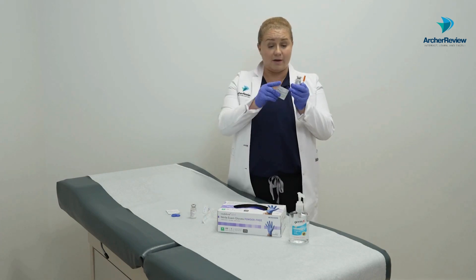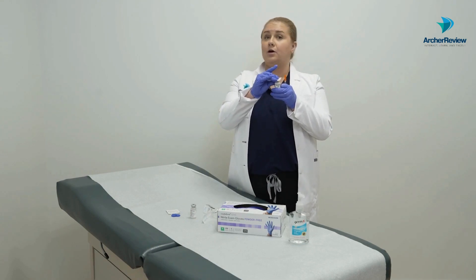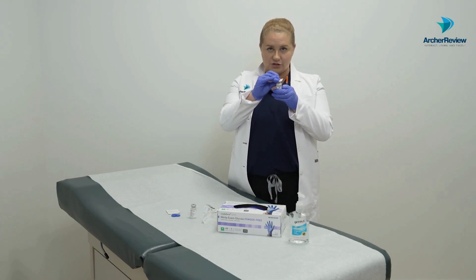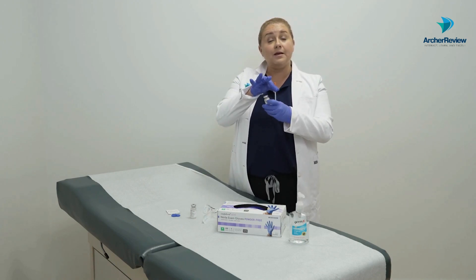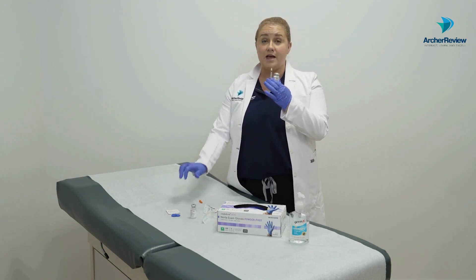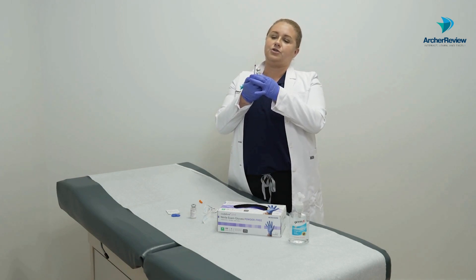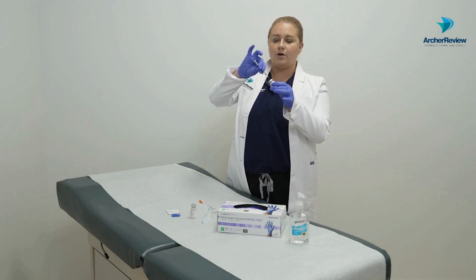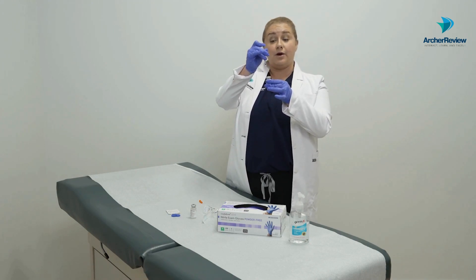That's where I get my first alcohol pad. I open it up and scrub the top of the NPH vial — we always scrub the top of our vials in case there's any contamination. Then I'm going to draw up two units of air in my syringe — that's the amount of NPH I'll eventually draw up — and inject that air into the NPH vial. Then I take the needle out and set that vial aside for later.